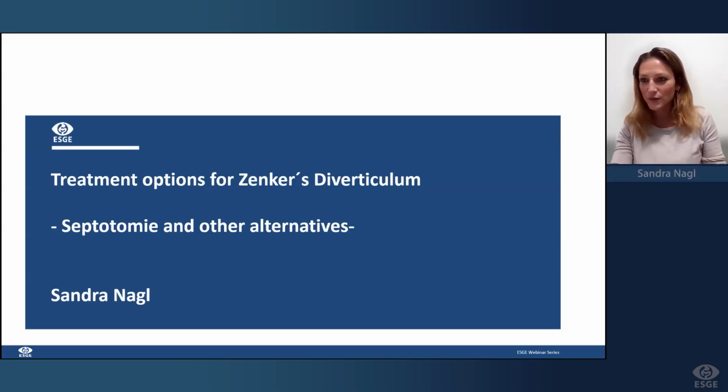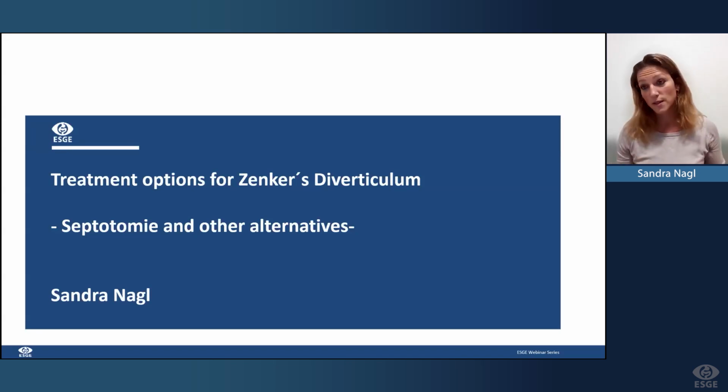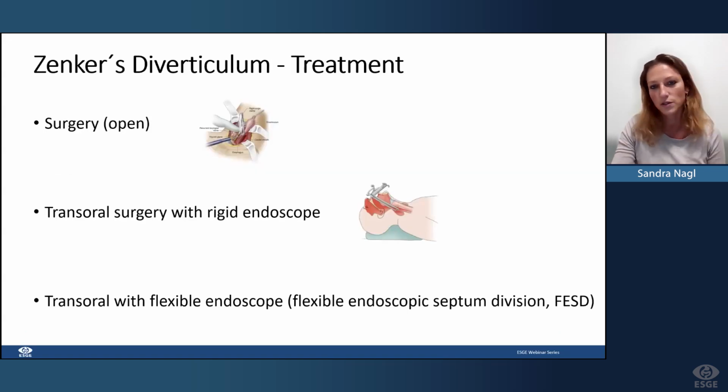Yeah, thank you very much for the kind introduction, Alessandro. We heard now about ZPOM, which is quite a new procedure in the armamentarium of treatment options for Zenker's diverticulum. But when we go a step back, historically Zenker's diverticulum is treated with surgical diverticulotomy performed either through open surgery or using a rigid endoscope.